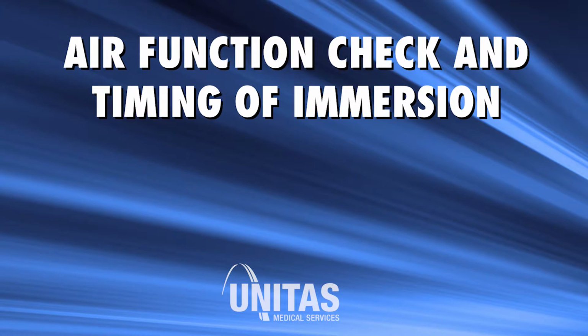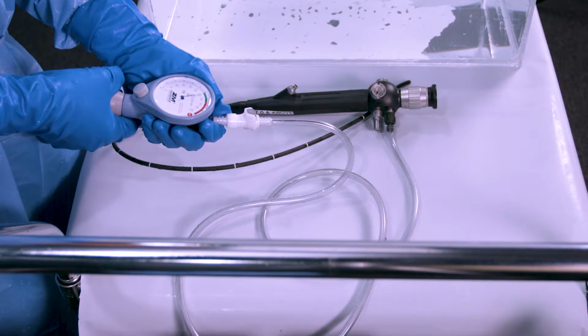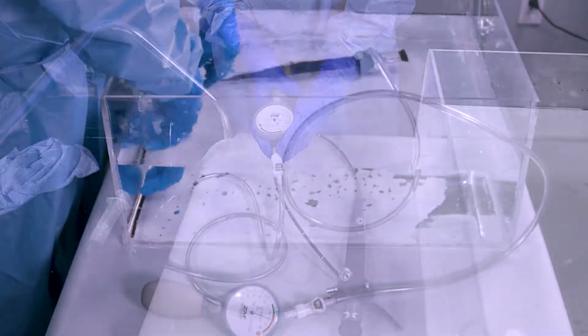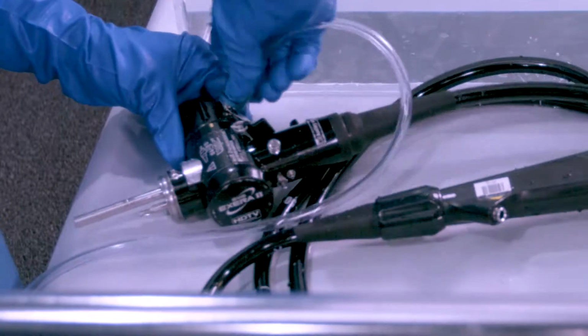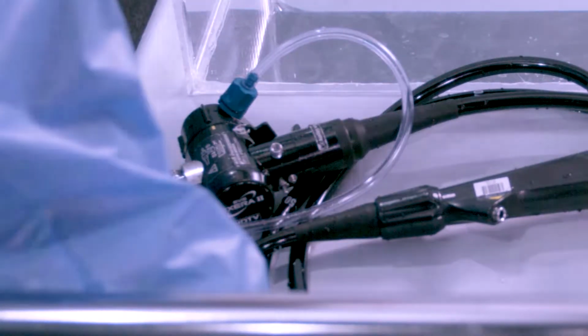Air function check and timing of immersion. Air function should be confirmed and insufflation initiated prior to any immersion of the endoscope in the water. Flooding the endoscope prior to leak testing is not recommended. The leak tester tubing adapter should always be connected outside of the filled sink.